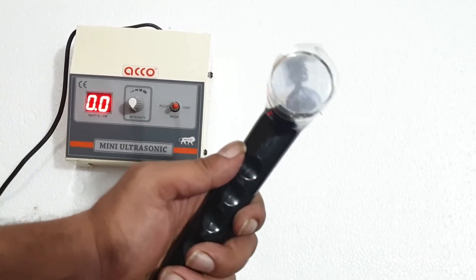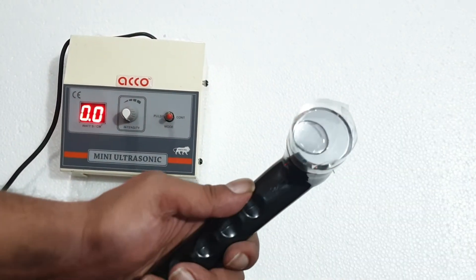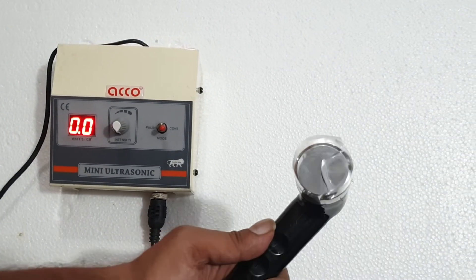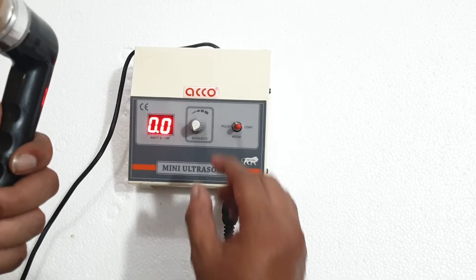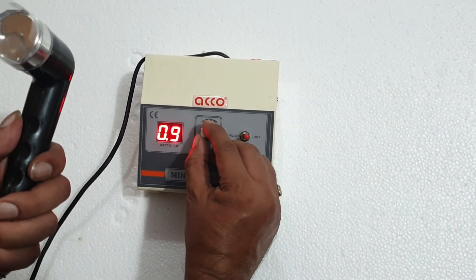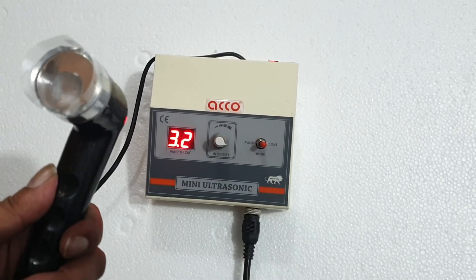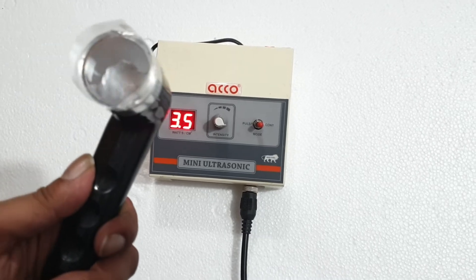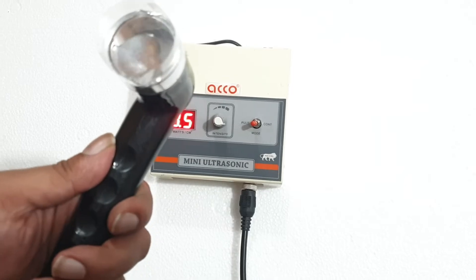Put some water on the handle for testing. Increase the intensity. You can change the mode from here — from continuous to pulse.